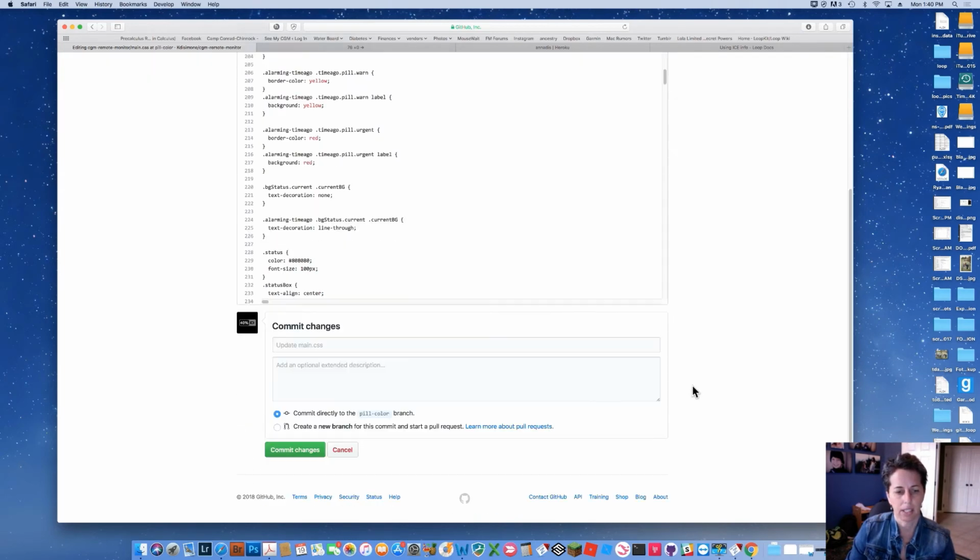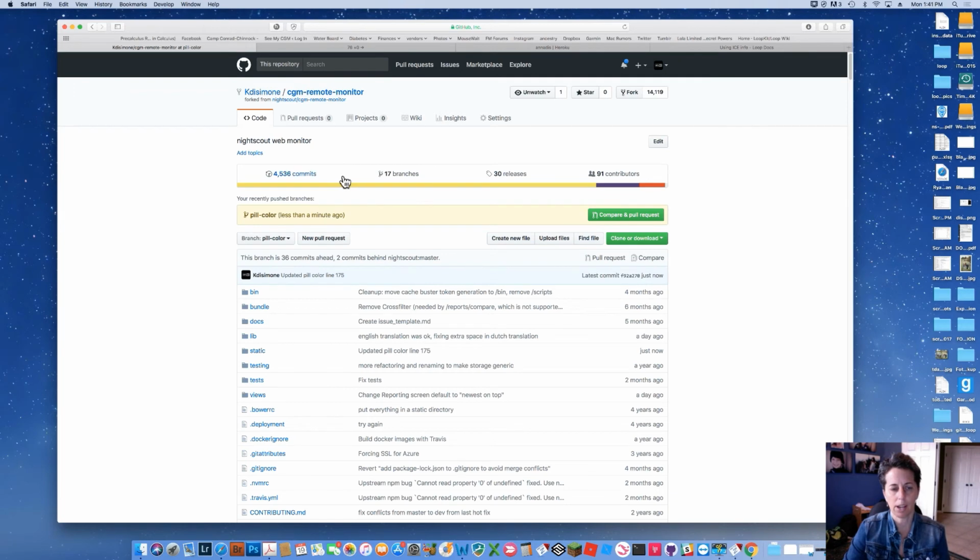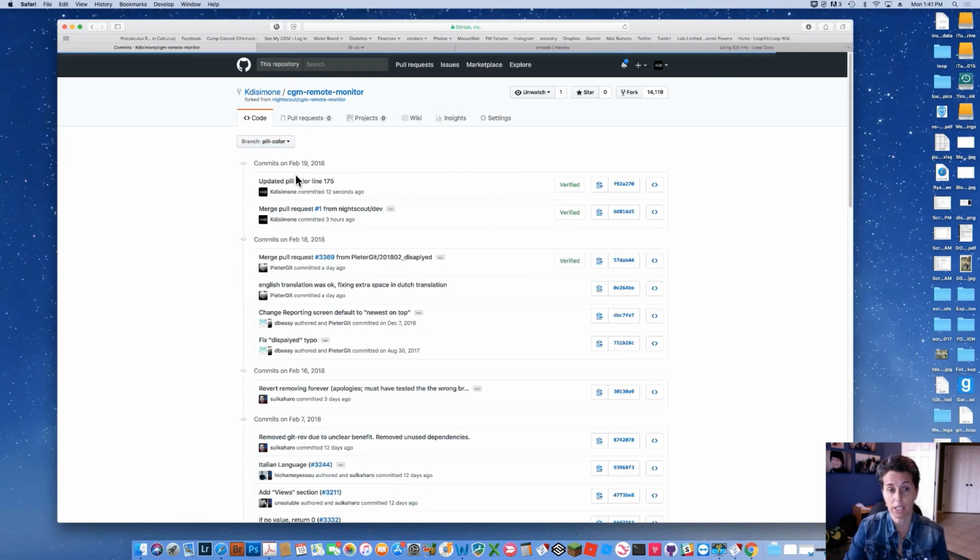And I'm going to write a commit message. I'm going to say updated pill color line 175. And that'll let me kind of know an idea. I'm going to commit the change directly to the pill color branch, or if I wasn't sure, I could create even a new branch, but I'm going to say, yep, that's the one I wanted. So I can go back to my code, and what we learned in the previous video is we could check the commit history, for example, and I say, yep, there's my pill color that I changed.